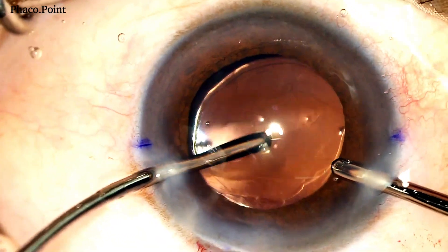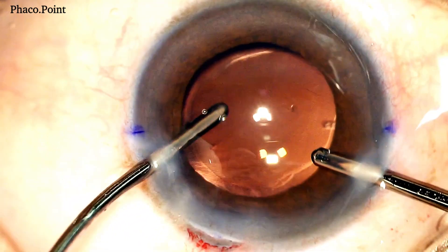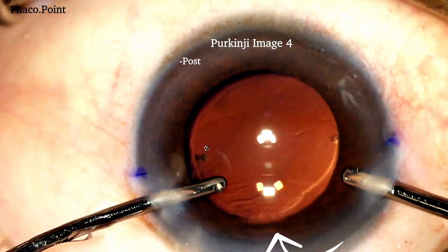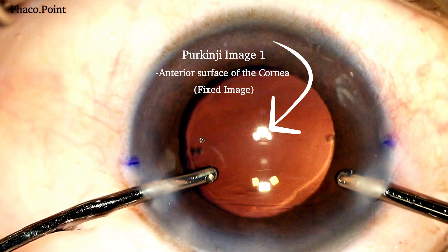The viscoelastic is cleared from the anterior chamber. Now let's get to the understanding of the final alignment. The inferior Purkinje image visualized here is the image on the posterior surface of the optic — this is Purkinje image number 4, and it is real and inverted. The superior image is the image on the anterior surface of the cornea; this is the first Purkinje image.